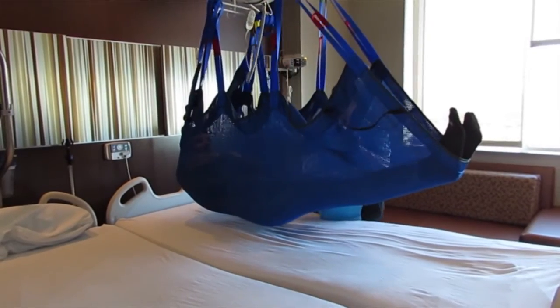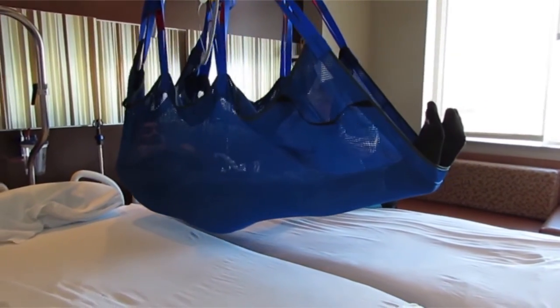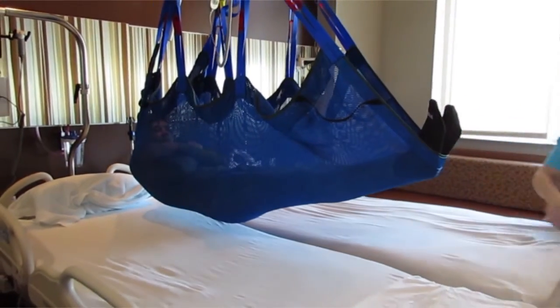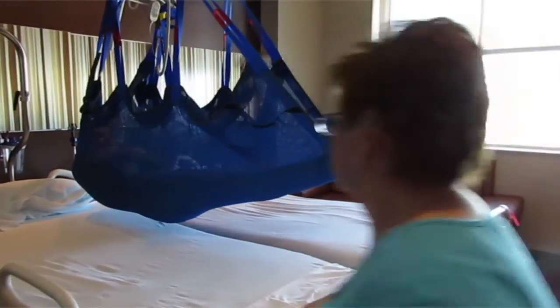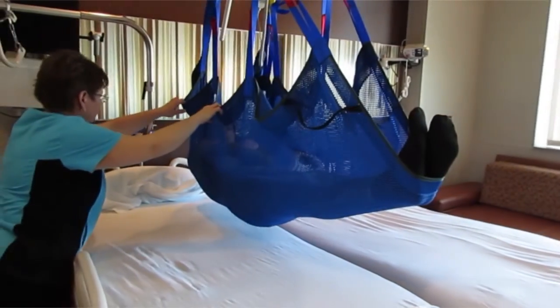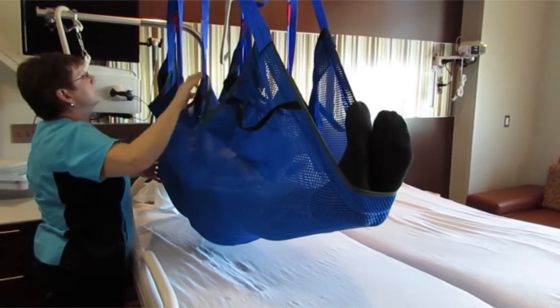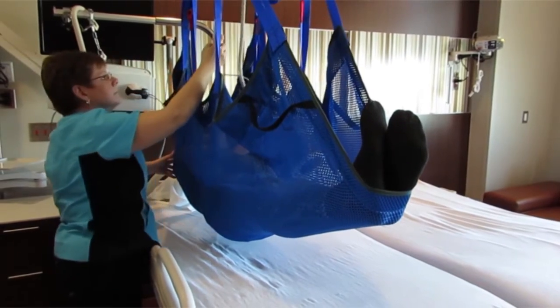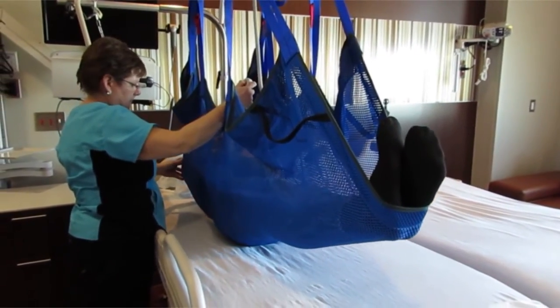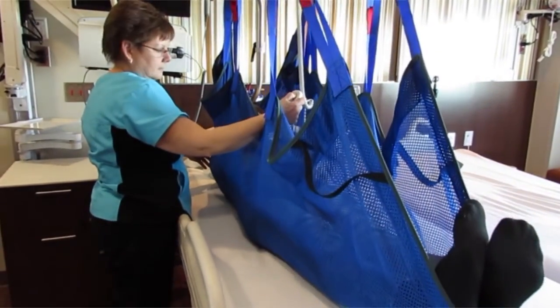To laterally transfer a patient to another surface, place the bed or stretcher next to the bed with the rails down on both beds. Raise the patient up and slide the patient over to the intended surface. If there is not enough space in the room to have two beds, simply lift up the patient off the surface and take the first bed out of the room and bring the second bed in, but be sure someone stays with the patient while the beds are being switched out.